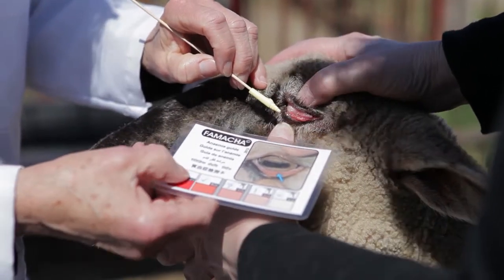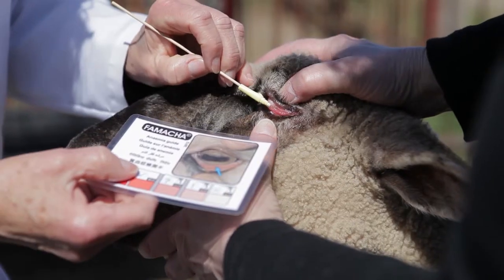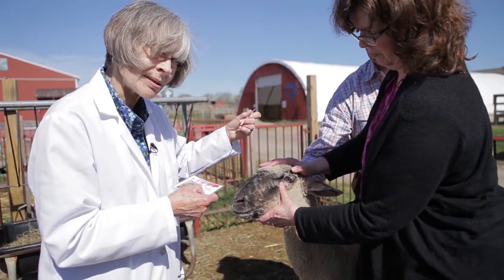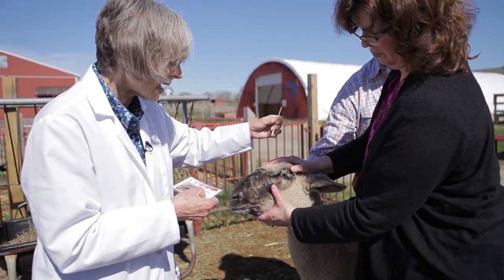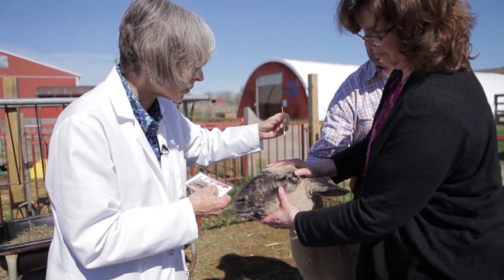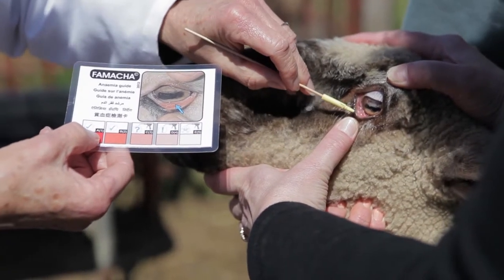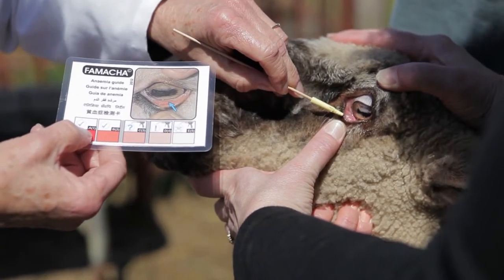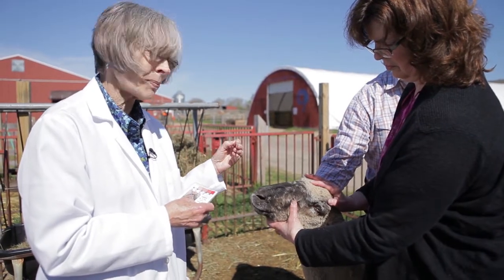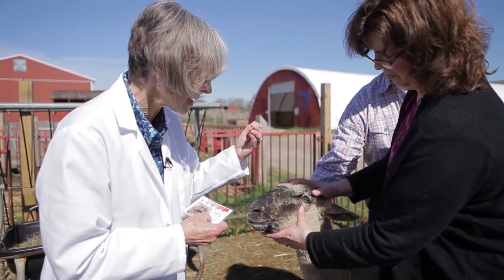This is what we're scoring — that nice beautiful bed of mucous membranes, and you can see how prominently they stand out. Now if Catherine did not push down and cover the eyeball, what she would show is only the margin of the lower eyelid right here, and that is not what you want to score, because usually that scores paler than the mucous membranes themselves — that bed of mucous membranes.